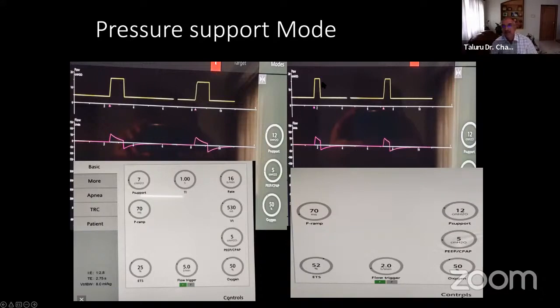And look at the volume also delivered. See here, the volume delivered. Flow into time, or the pressure achieved. You can see this is the volume delivered. Flow into time is volume delivered. Flow into time is volume delivered here.